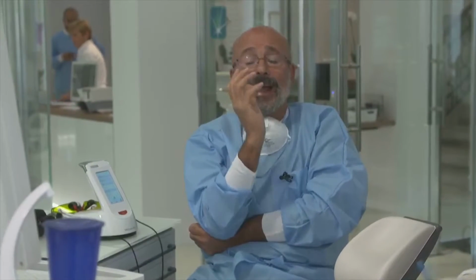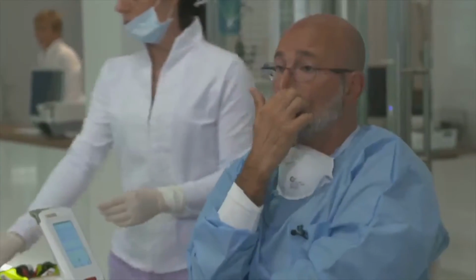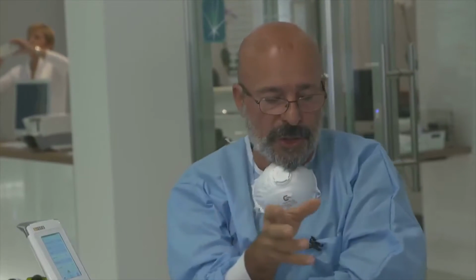The inflammation is the phase in which the inflammation clears the debris of the injured tissue. So this second phase is a little bit longer using a laser than a conventional scalpel surgery.